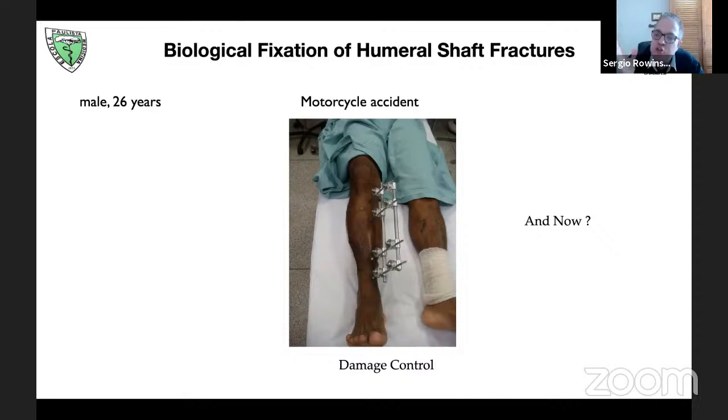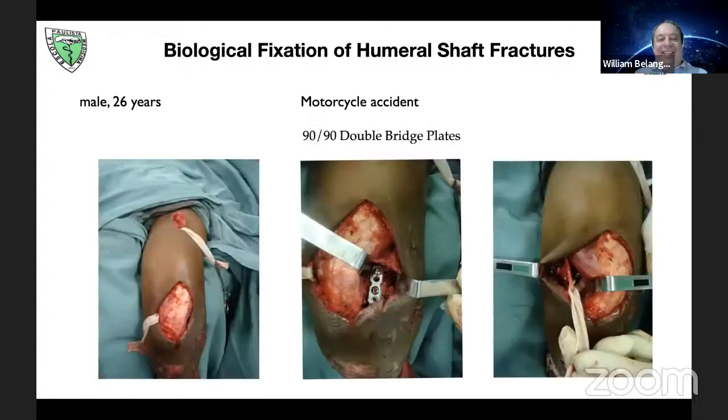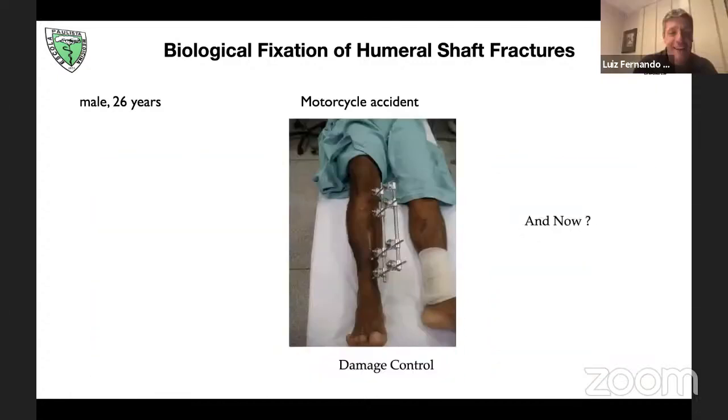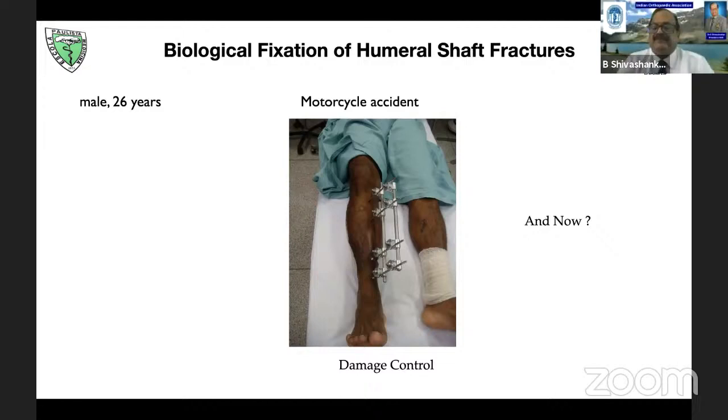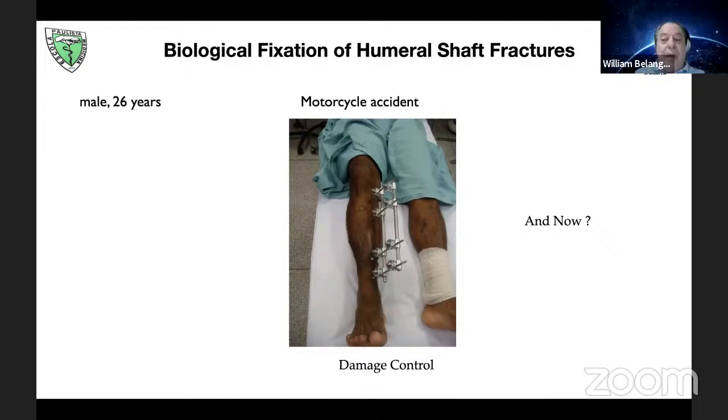Dr. Coco, please, do you have post-op X-rays of the external fixator? This is a key question. No, I don't. Okay. But Dr. Belangero, both at the same time, bridge plates. I think it's okay to do both at the same time. And for the humerus fracture, I try to do a biological treatment, a MIPO technique. I'd like to see the size of the distal bone fragment, but you don't have it.